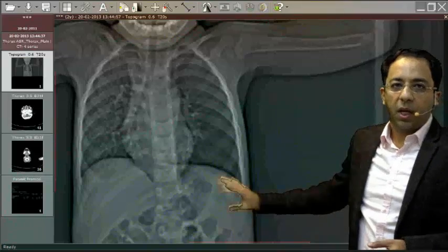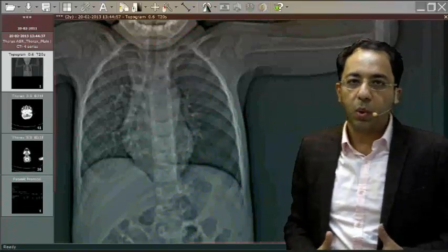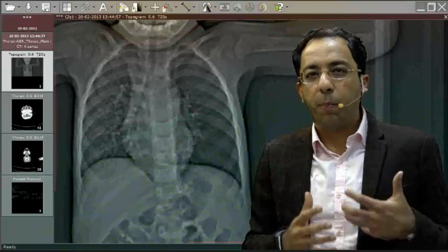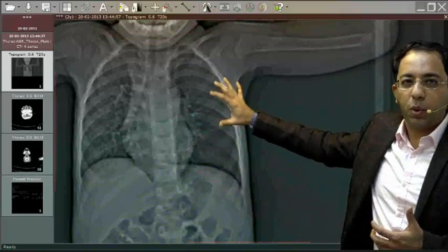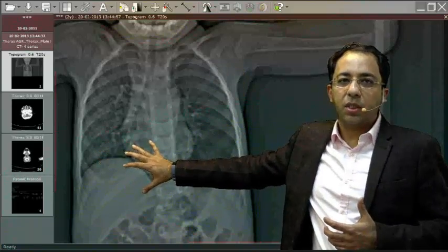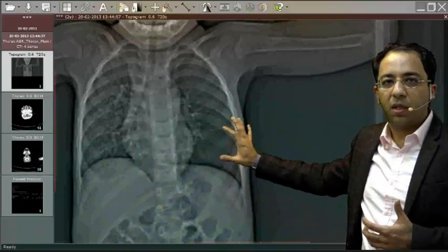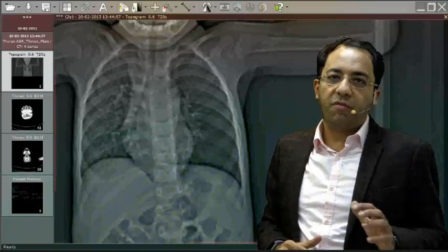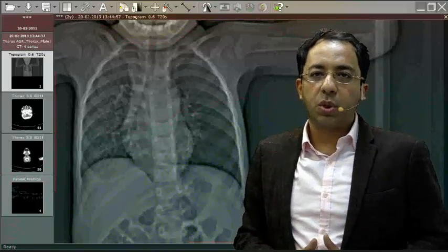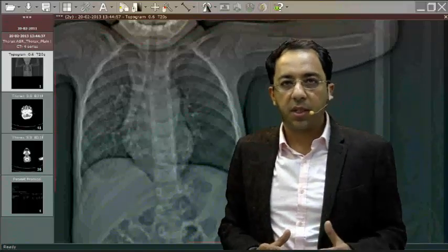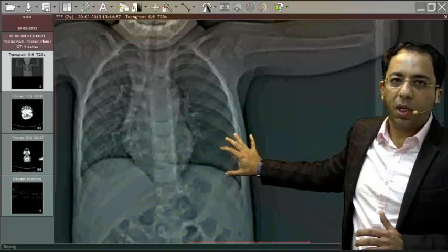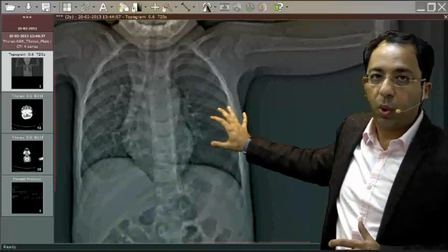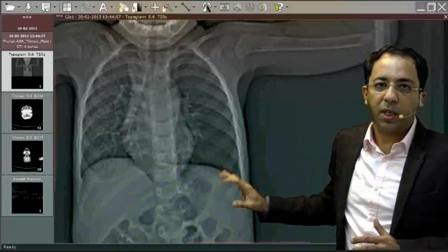This is the x-ray chest in front of you, two-year-old child. I am able to see that the left lung of this child is looking hyperlucent. I hope you are able to see it looking more black than the right side. Usually one-third of the heart is towards the right of the spine, two-thirds here, but this is slightly pushed to the other side. So there is some mediastinal shift, there is a hyperlucent left hemithorax. Although this area is hyperlucent, you are still able to make out the vascular markings, although they look attenuated.